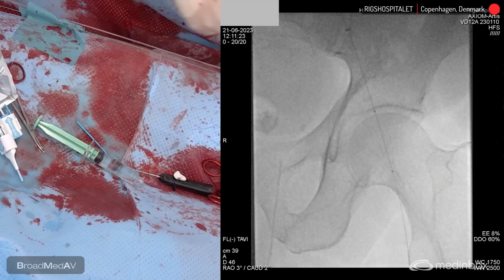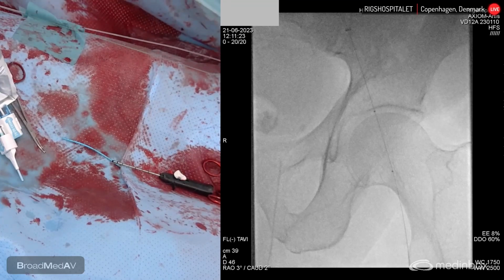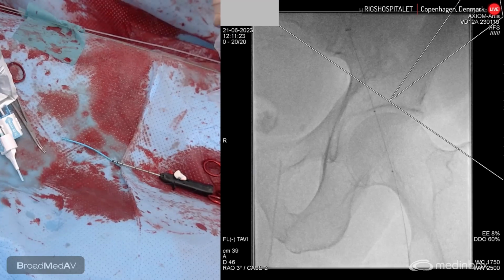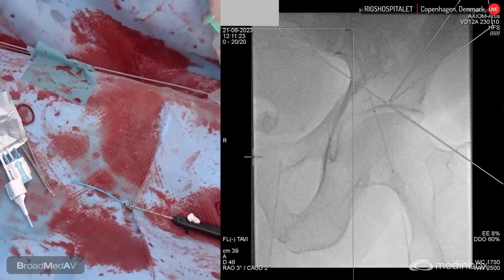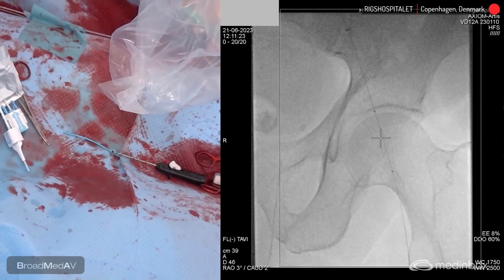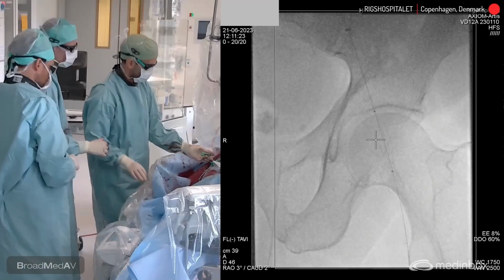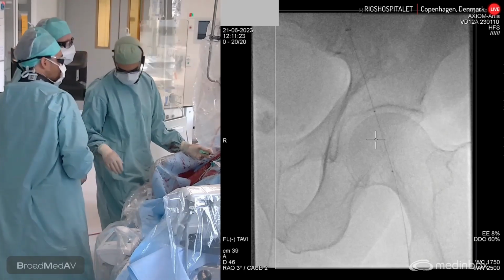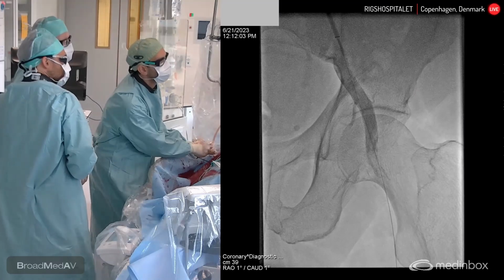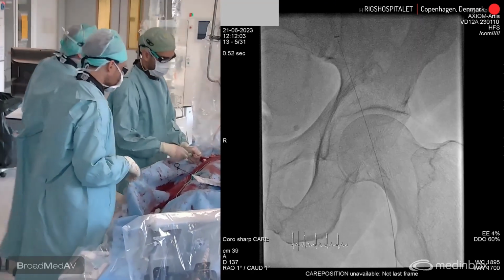Then you can grab this here. Okay, let's check it now. Can we check on the fluoro? Nice fluoro, it's good. You were good, you were in a good position. Okay, let's just film. Go ahead. Just film it. It will be good, I'm pretty sure. You see, I know it's going to be good.